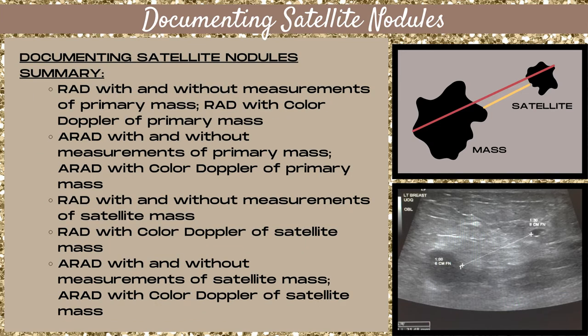Here are the steps for documenting satellite nodules on a breast ultrasound. You want to take a radial image with and without measurements of your primary mass, and a radial color Doppler image of your primary mass. You also want to take an antiradial image of your primary mass with and without measurements, and an antiradial color Doppler image of your primary mass.